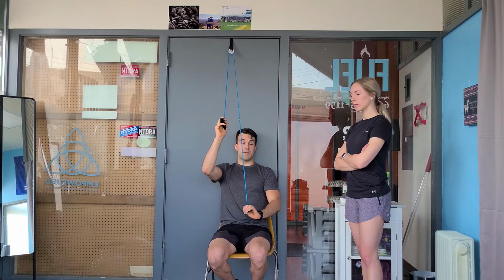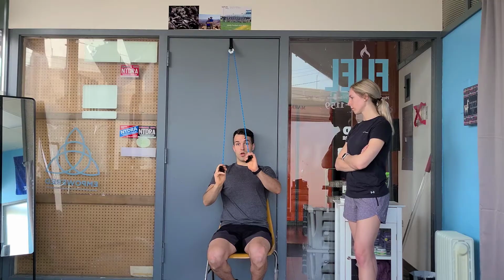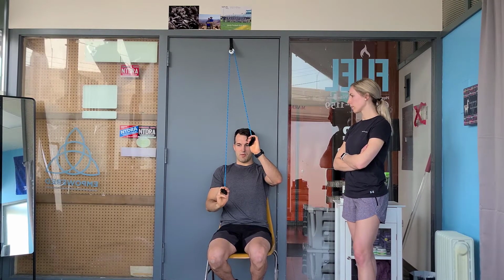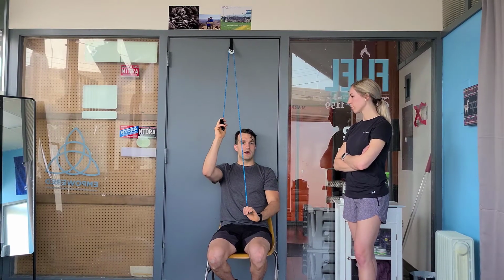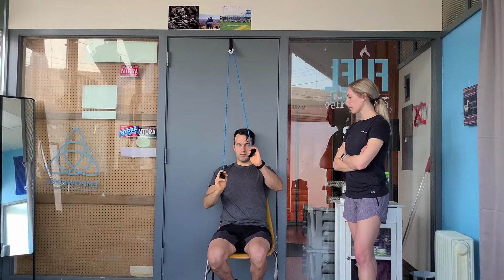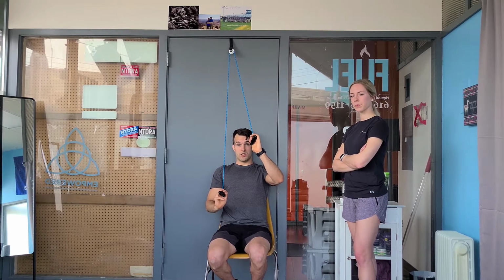And you could either count reps. I'll either do reps of 30, or I'll even just do it for time. So I'll do it for like 3 minutes and set a timer. Either way works, but going for some higher repetitions is always a good thing. It shouldn't be super uncomfortable. You should feel it get a little tight, stiff, maybe a little bit of uncomfortableness, but if you just had surgery, you need to make sure you follow your physician's recommendations.